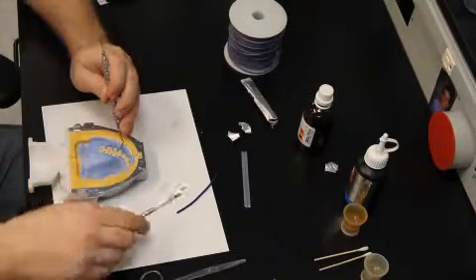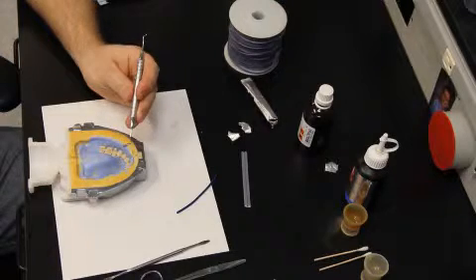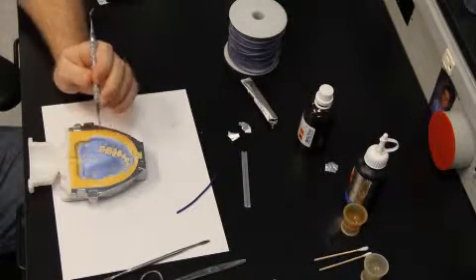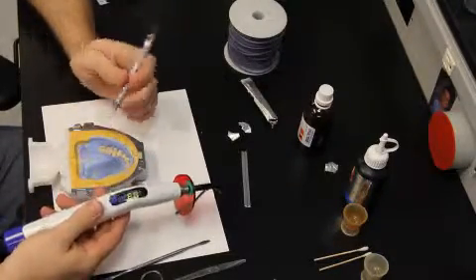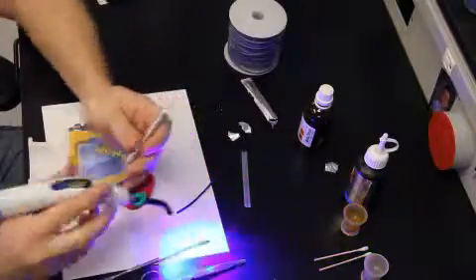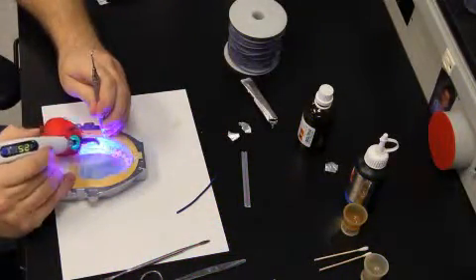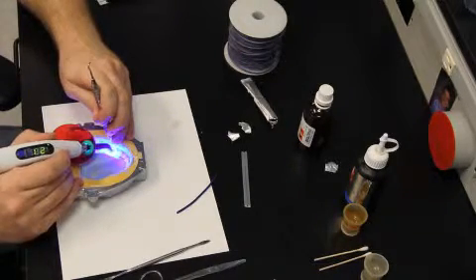So now I'm going to start curing it. The reason I like the step off bit is because it kind of acts like a shield while you're going around and curing each tooth. So grab your favorite light curing device and start curing away. So what I'll do is I'll block off some of it. I'll jump in there, cure a little bit. Next tooth, cure a little bit.